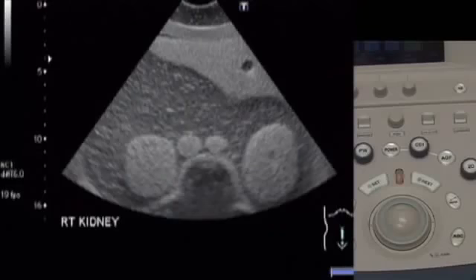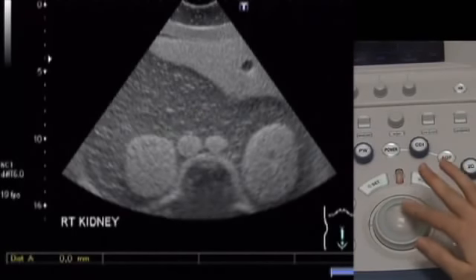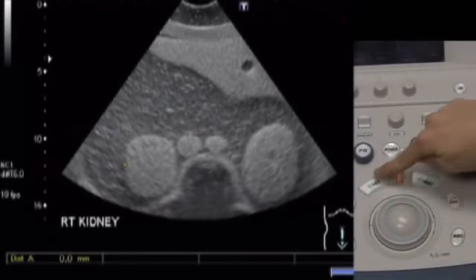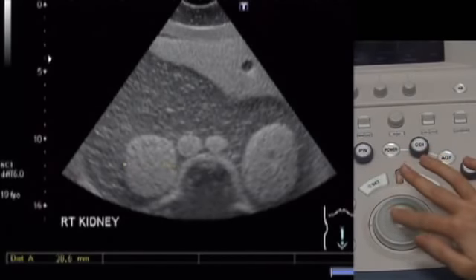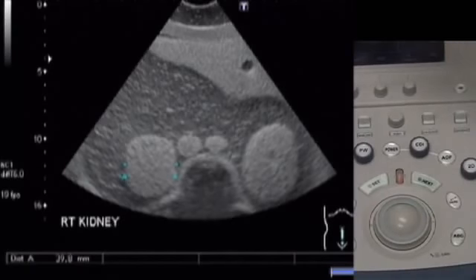To measure a part of your image, press the caliper button. Then use the trackball to move the cursor to one edge of the object you wish to measure and press set. Then move the cursor with the trackball to the other edge of the object and press set again. The length will appear at the bottom of the screen.